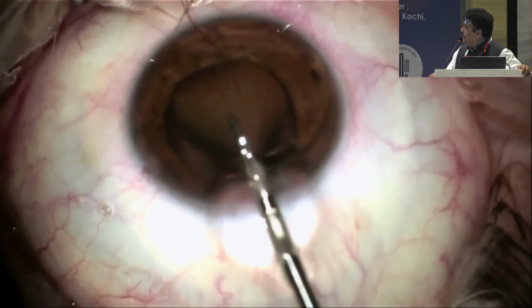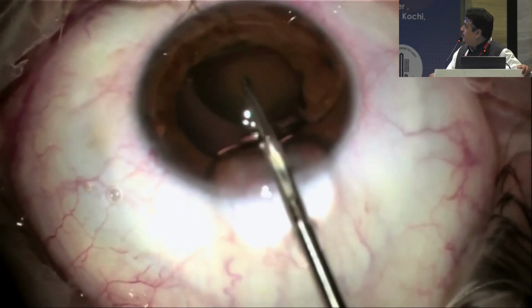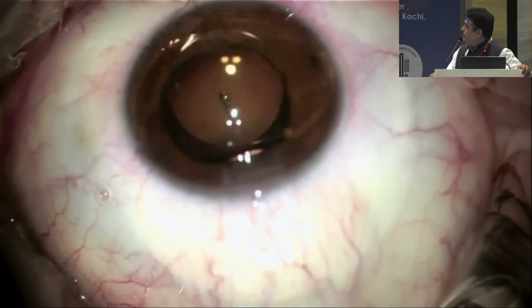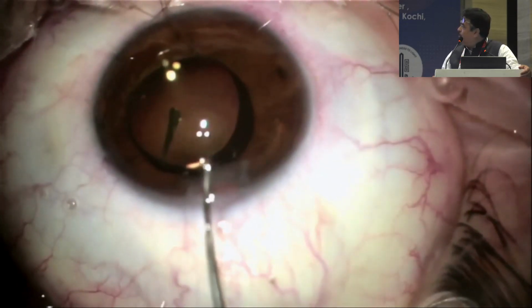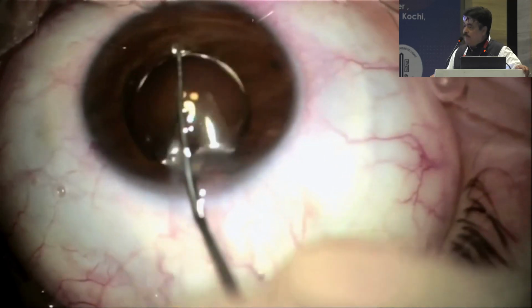With this simple scissor, we just cut, not through and through. This hydrophilic lens, we have to cut not up to the center, but less than the center. There are many techniques. If you remove this lens now, even then it will come out. But to show you different techniques, I am making one more incision. So we make a curve, a triangle type curve.